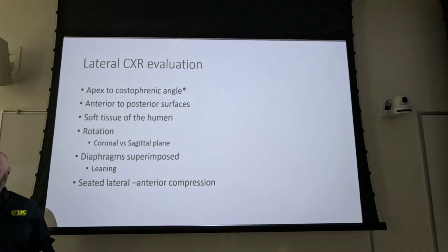The basics of hydraulics is you can't compress fluid. What is all that essentially? It's fluid, it's mass, it's soft tissue, which is primarily fluid. If you can't compress fluid, it's going to go somewhere. So you set the patient up, this goes into the thighs, which can't be compressed. It might displace a little bit, but it's going to push up, and that prevents your inferior lobe from inflating. So it's not really foreshortening, it's compression, but whatever. We'll call it foreshortening because that's what Martensen likes to call it.